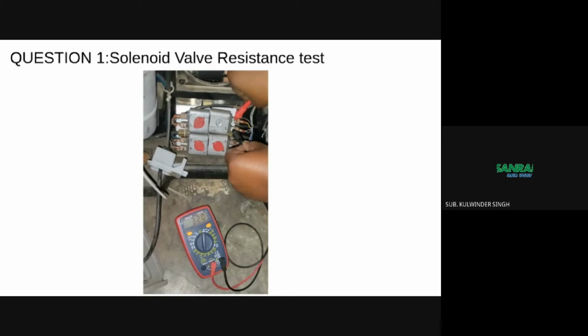You can confirm that the coil is faulty by testing the resistance of the coil. While the concentrator is off, place the two probes of your multimeter, keeping it at the ohms continuity position, on the two pins of the valve. The resistance of the coil should be around 3.2 kilo ohms if the solenoid valve is in good shape for the feed and the base valves. In case of the equalizer valve, it should be nearly 4.2 kilo ohms.